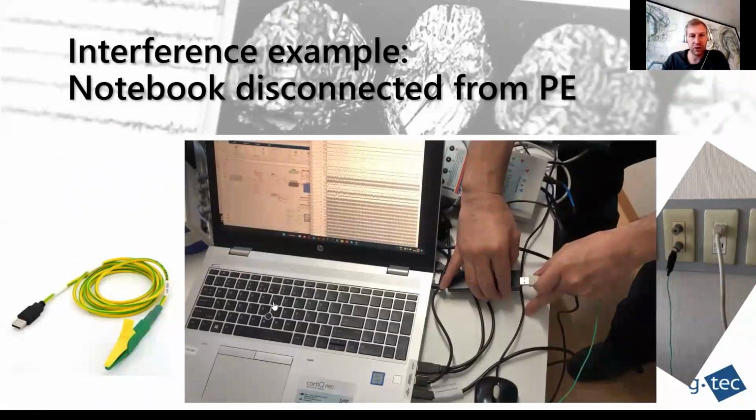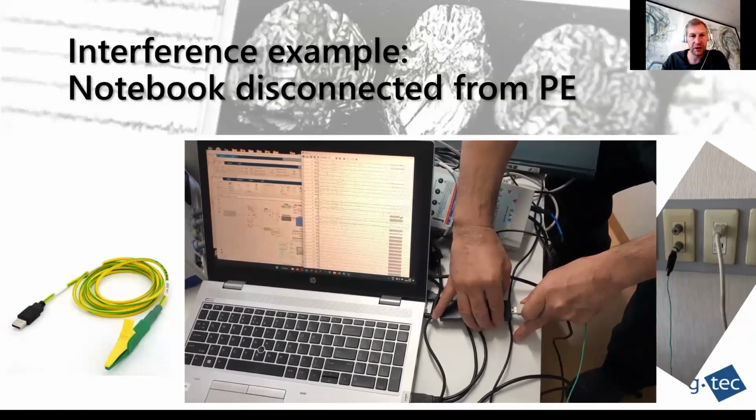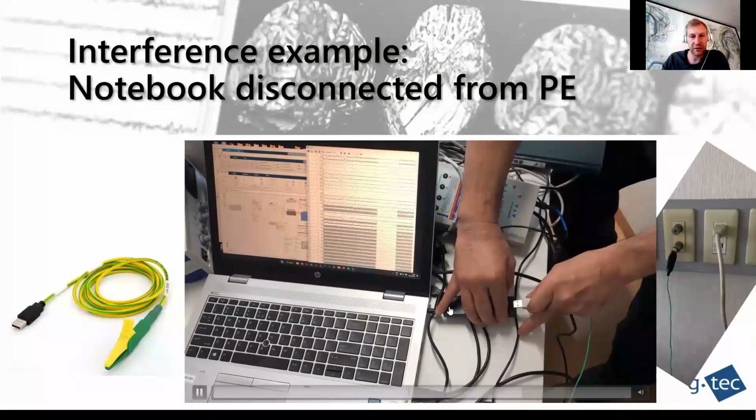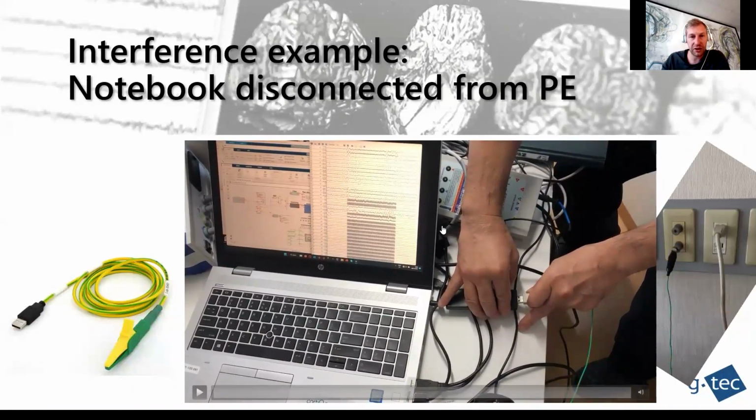And one solution is that we make sure that the notebook is always powered with a power supply that actually has a good Earth connection. So we have to be sure.